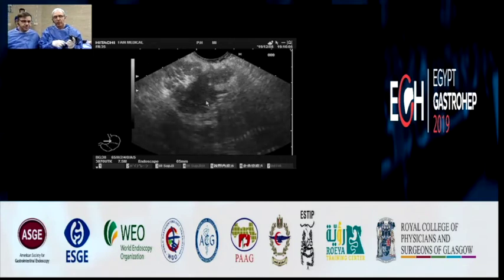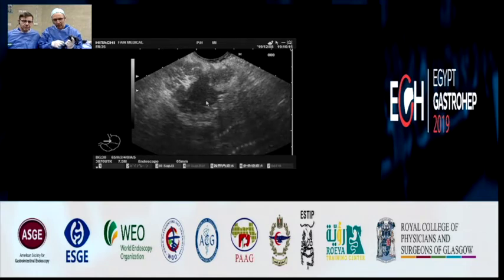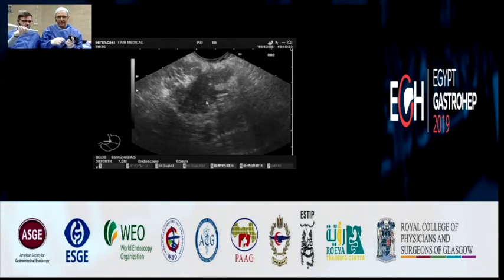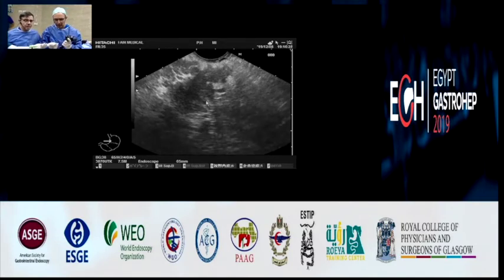Professor Giovannini, as regards autoimmune pancreatitis with extensive fibrosis in type 1 with storiform fibrosis, we may expect also to have some sort of dilatation of the pancreatic duct. So the mere dilatation of the pancreatic duct does not indicate malignancy only, but it could also be autoimmune pancreatitis.